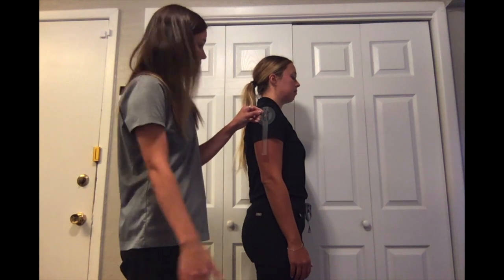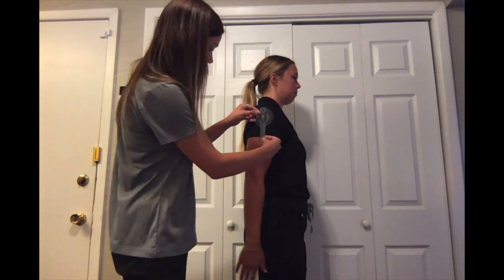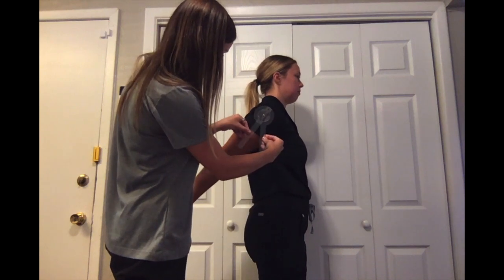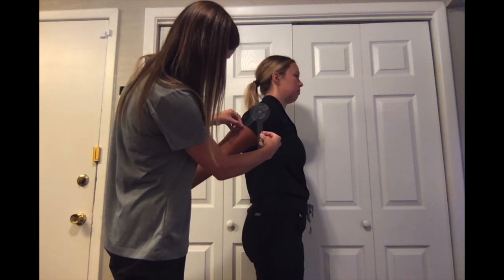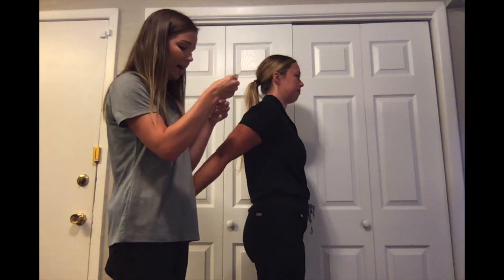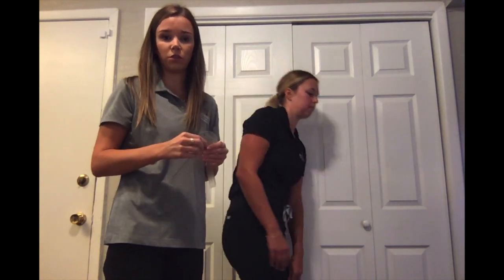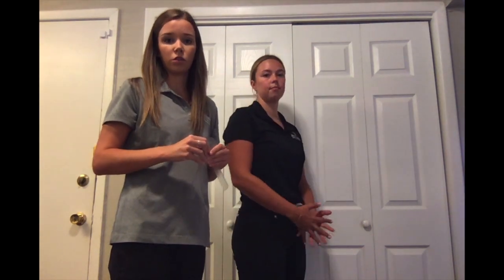Addison, I want you to reach your arm back as far as you can for me. Can you give me any more? Addison has 54 degrees of shoulder extension. The norm for shoulder extension is approximately 60 degrees.